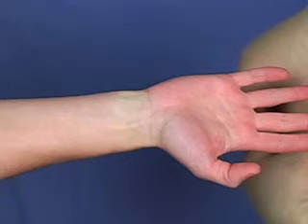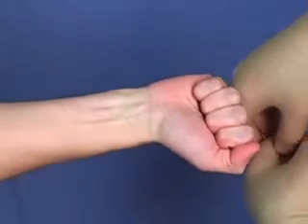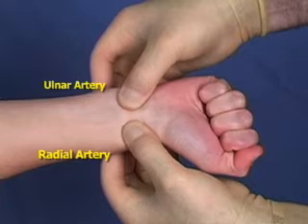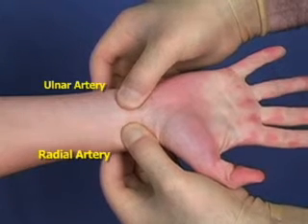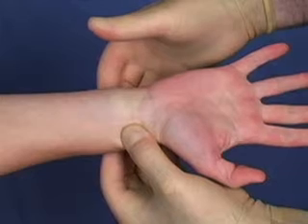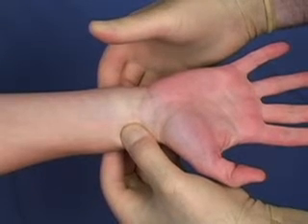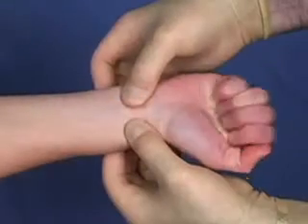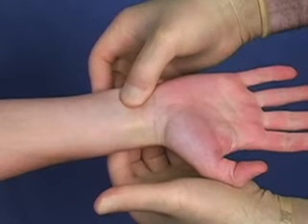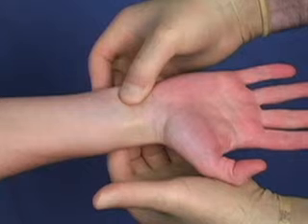While the value of the Allen test has not been firmly established, it may give some qualitative assessment of collateral perfusion. In the Allen test, the operator occludes both the ulnar and radial pulses while the patient tightly clenches their fist. The hand is then opened and pressure on the ulnar artery is released. Circulation should return to the extremity within 5 seconds, with delayed return suggesting poor collateral circulation. The test should then be performed on the radial artery circulation in the same manner.